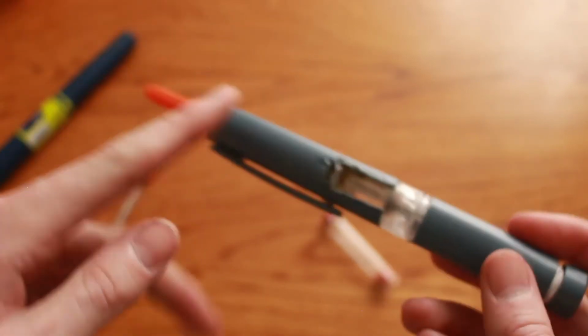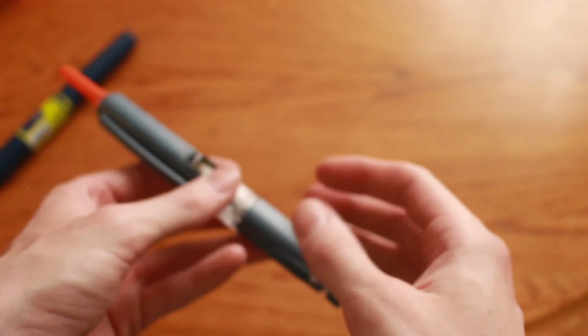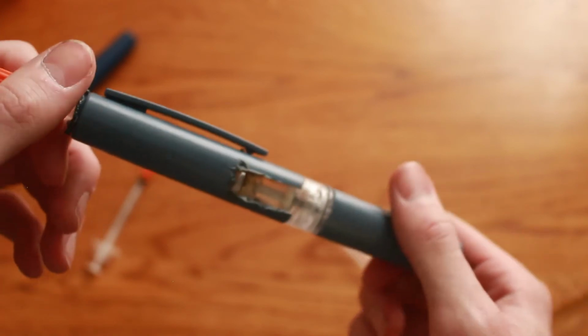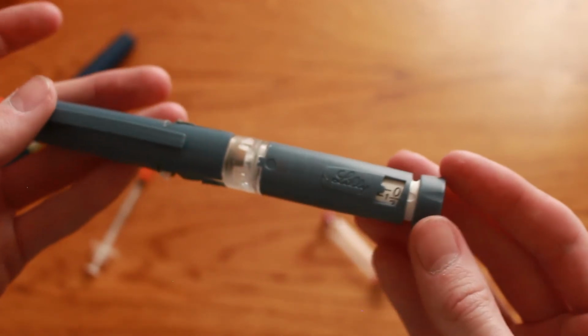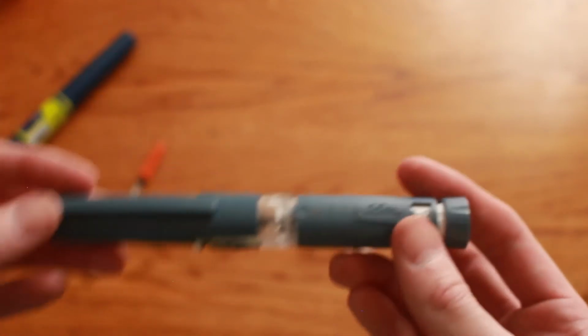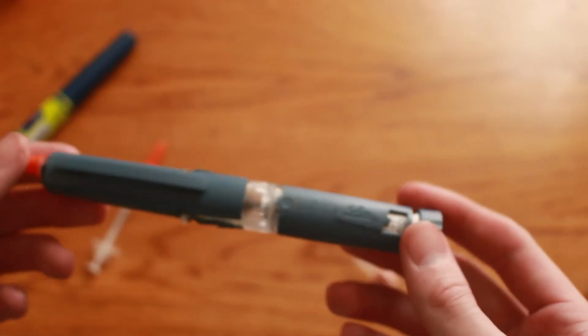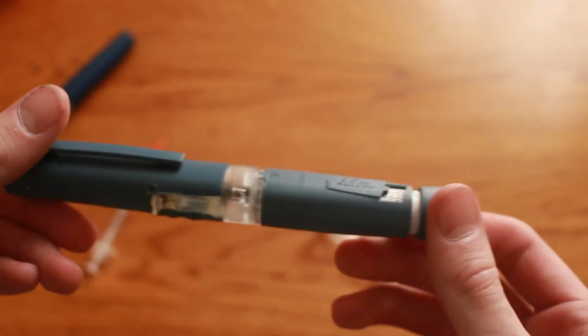My mission for you, if you choose to take it, is let's say you have an old Kwikpen that's out of insulin. Before you throw it away, consider sending it over. I'll experiment on it, and we'll make more of these, and we'll have some very beautiful, interesting stuff here. Now, I'm not asking for insulin. I have plenty of insulin, but I need these Kwikpens in particular, which right now for me are tough to access. So if you have any of these empty Kwikpens, don't throw them away. Send me a message, send them over to me. I would love to use them. And if you give me multiple, hey, maybe if it works out, I'll send you one back and you'll have one of these for yourself.